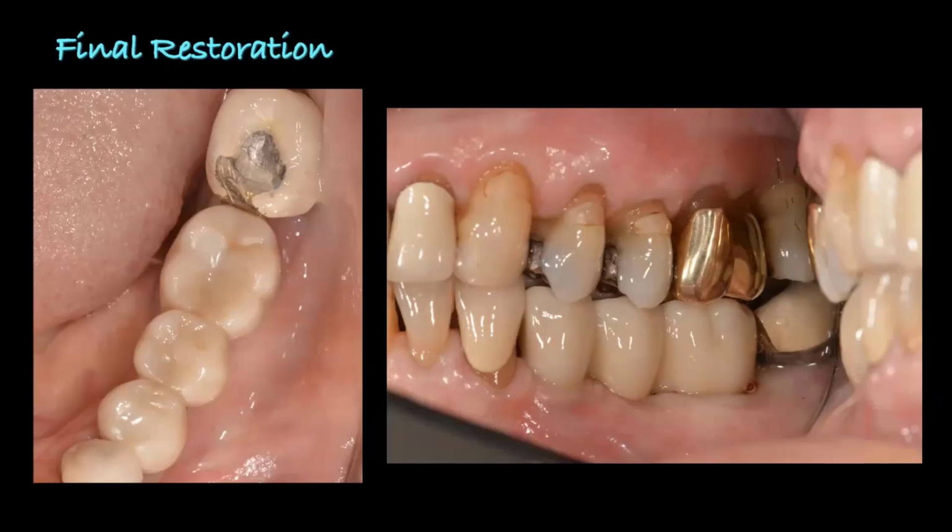And all of this, once again, starts with taking a cone beam CT scan. Having a cone beam CT scan will allow you to get the information to diagnose the case, measure the bone, plan the surgery, and then execute the surgery properly, and do all the other parts of the workflow that really help you. There's more and more evidence that shows that even if you just do a CT scan and plan the case on it and have it open during the surgery, even if you don't do guided surgery of any type, your results are always better.